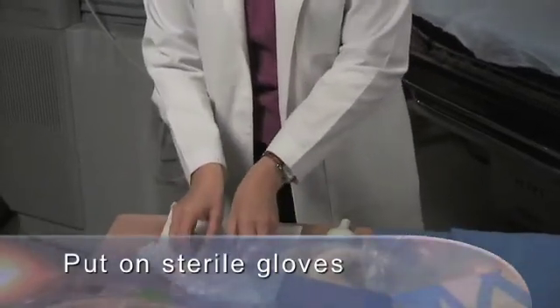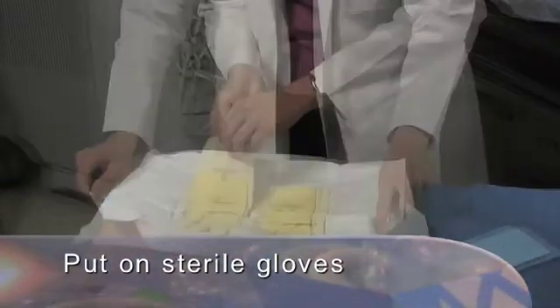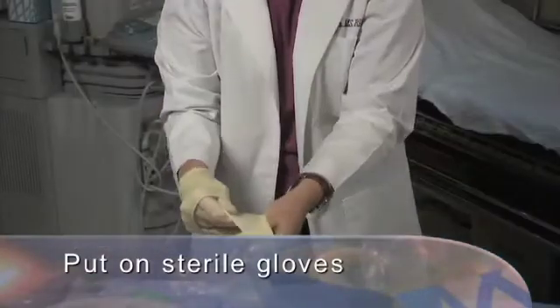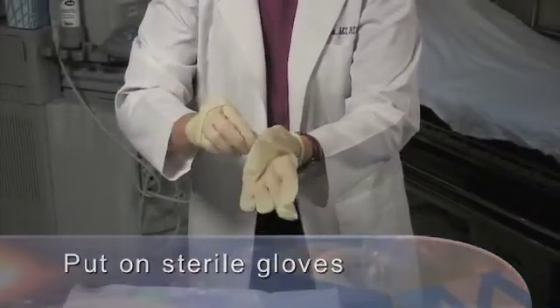Open the pack to expose the cuff area of the gloves. Touching only what will be inside of the glove, get the first glove on and then the second glove.